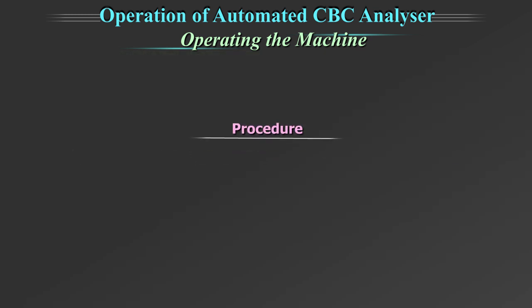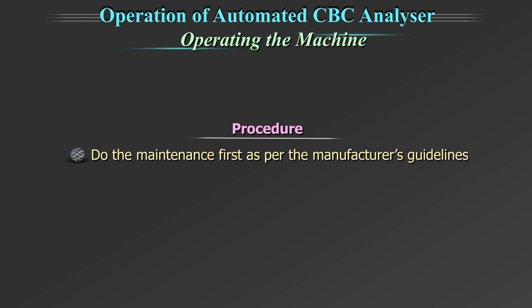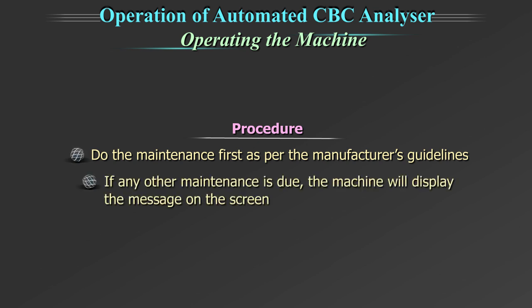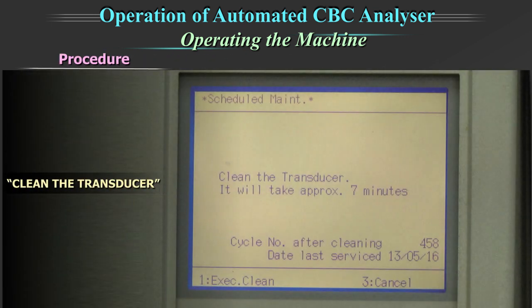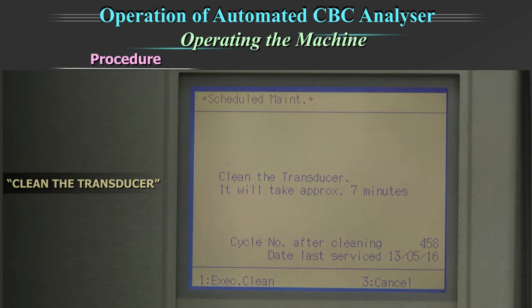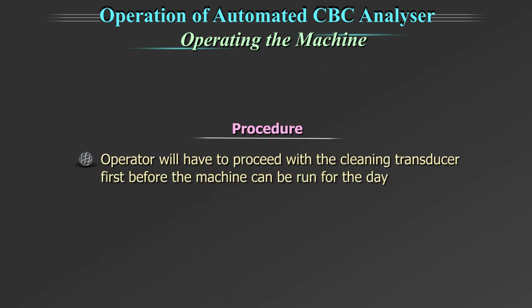Do the maintenance first as per the manufacturer's guideline. If any other maintenance is due, the machine will display the message on the screen. Here, the machine shows the message 'clean the transducer.' The operator will have to proceed with cleaning the transducer first before the machine can be run for the day. Further details of cleaning the transducer are discussed later in this section.